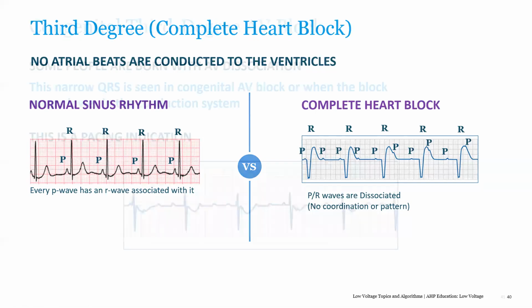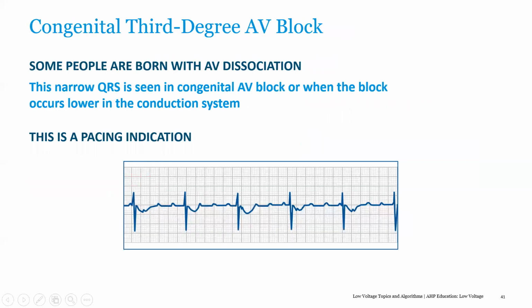In congenital heart block, we were talking about this early, patients who are born with this and their conduction systems don't degenerate over time. Sometimes we see them, if you see this is a nice tight QRS, and obviously these P waves aren't associated with it. So that's a junctional rhythm, a junctional escape. We'll see that with congenital heart block sometimes.